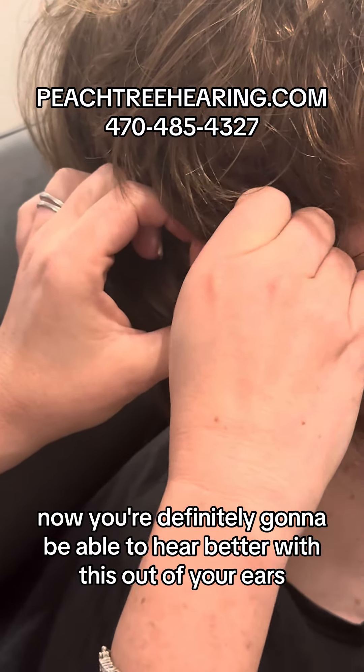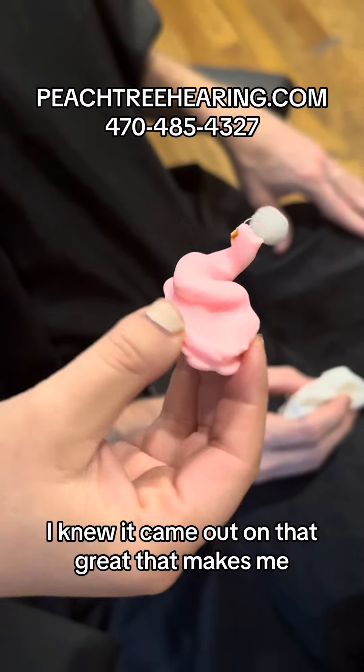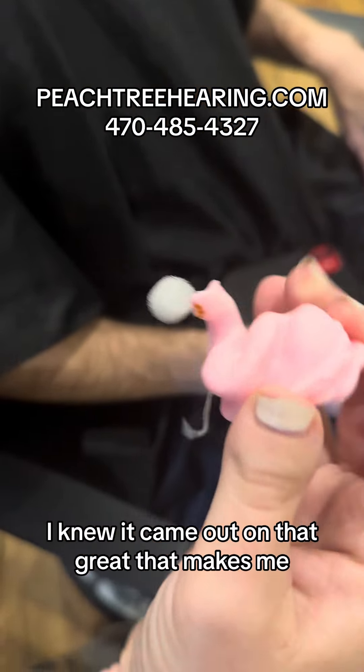Now you're definitely going to be able to hear better with this out of your ears. But that looks really good right there. And that was that little piece — I knew it would come out on that. Great. That makes me happy.